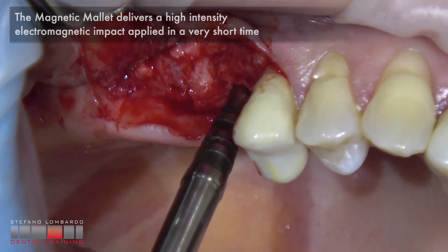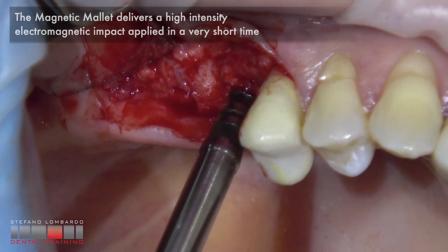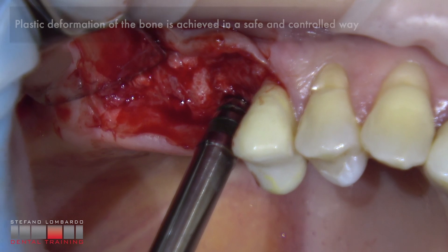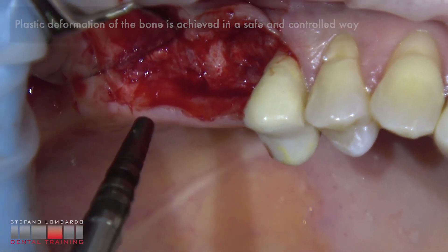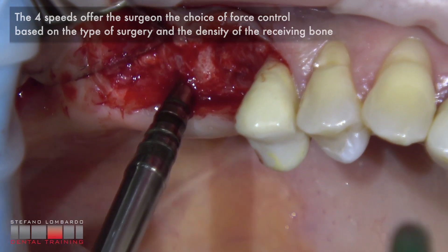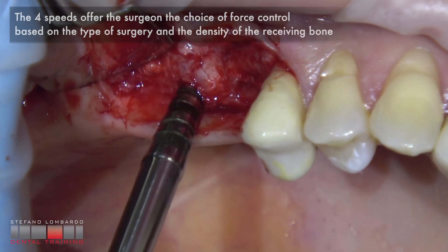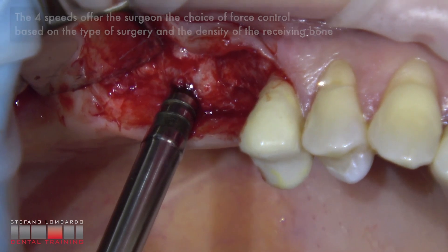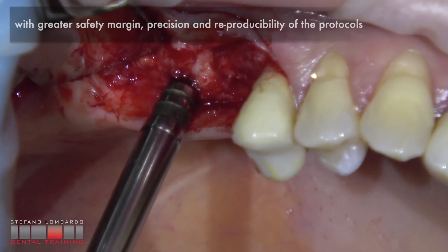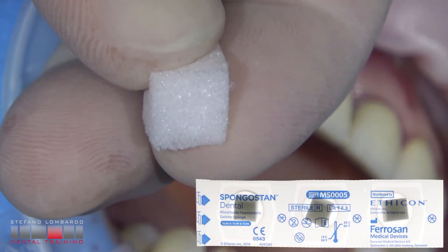The magnetic mallet delivers a high-intensity electromagnetic impact applied in a very short time. Plastic deformation of the bone is achieved in a safe and controlled way. The force settings offer the surgeon choice of force control based on the type of surgery and the density of the receiving bone, with greater safety margin, greater precision, and greater reproducibility of the protocols.